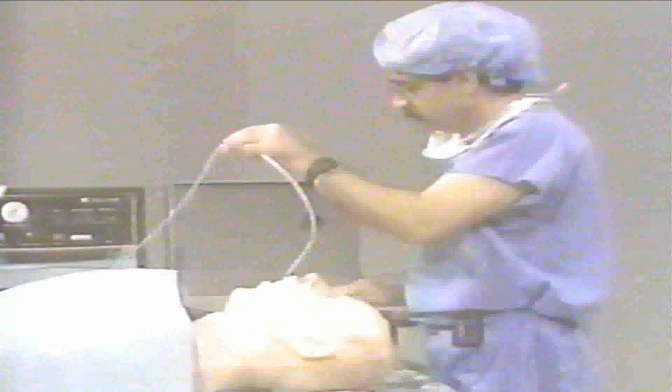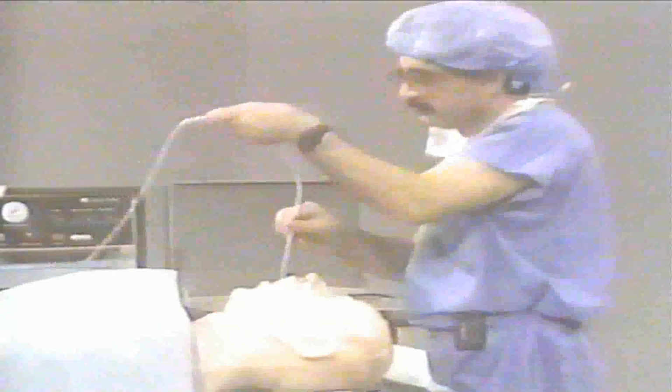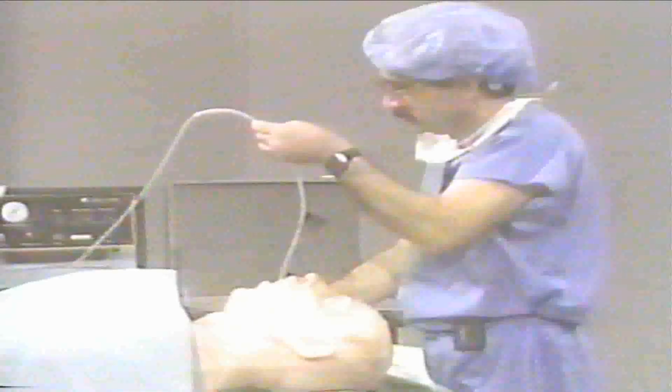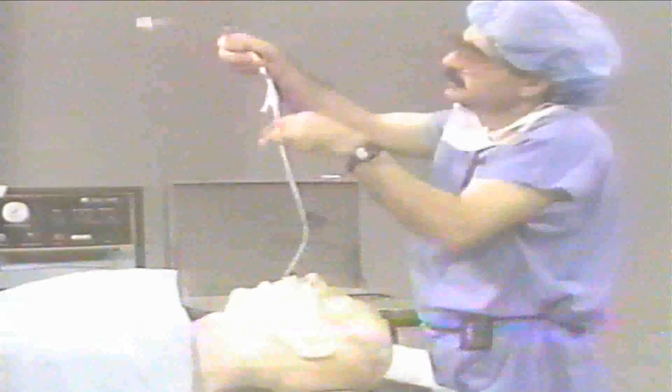Laryngoscopy is done. The catheter is placed inside the trachea. Then this can be attached to high-frequency jet ventilation. Patient can be ventilated with high-frequency jet ventilation, and after the patient is ventilated, if it's needed, we can exchange this catheter with a regular endotracheal tube. Then the catheter is removed and the patient can be ventilated with either an ambu bag or the anesthesia machine.